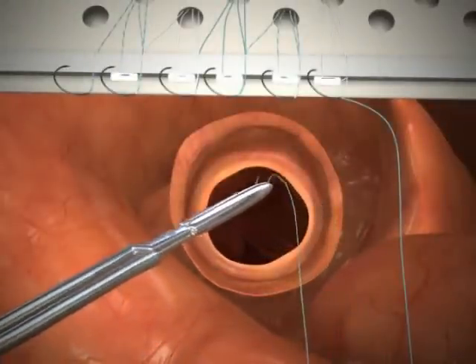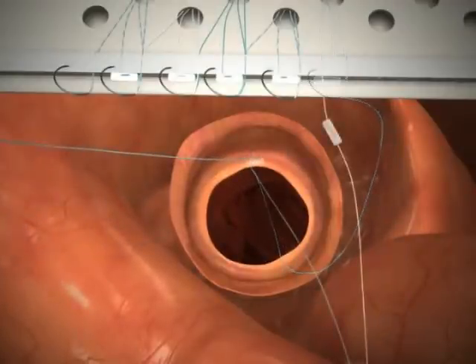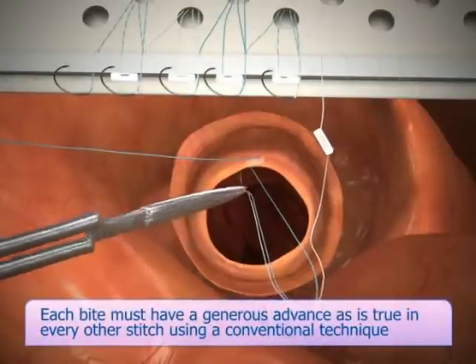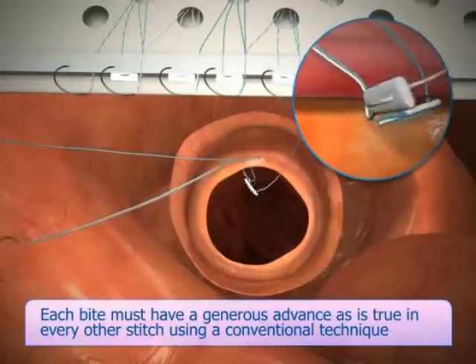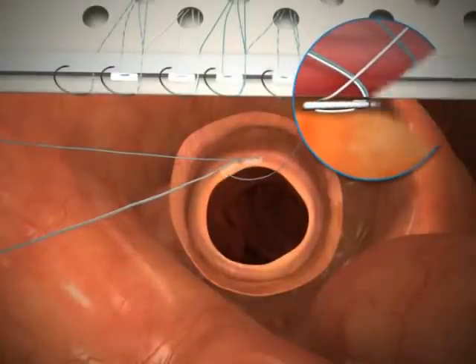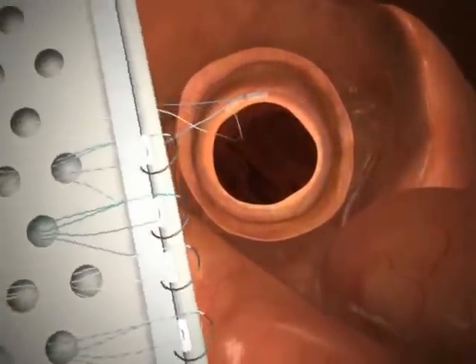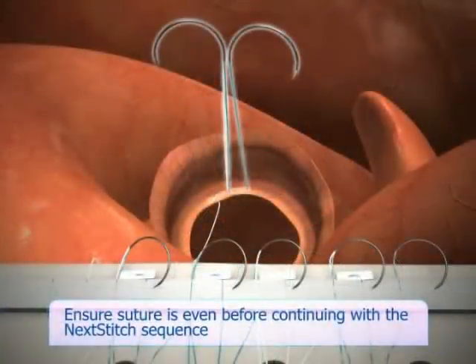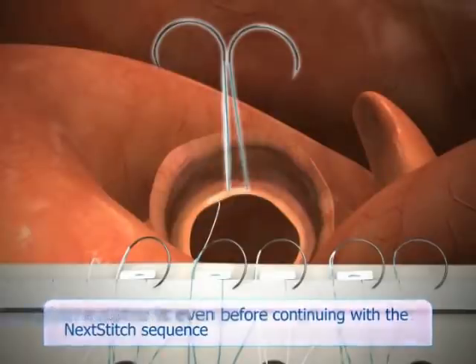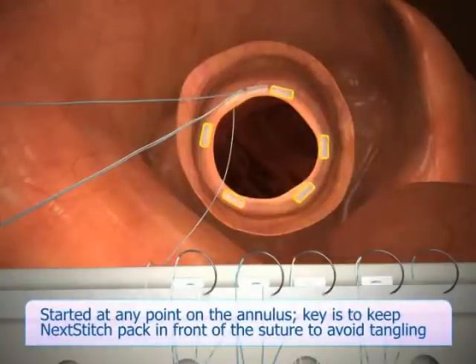Assuming you place your first suture at 12 o'clock, pass the needle through the valve annulus. For pledgeted suture, pull up on the suture until the pledget is properly seated on the annulus. Forceps may be needed to ensure the pledget seats appropriately. After the second needle pass, move the pack to six o'clock. Ensure the suture is even before continuing with the Next Stitch sequence. Next Stitch may be started at any point on the annulus; this scenario was used to describe pack movement.